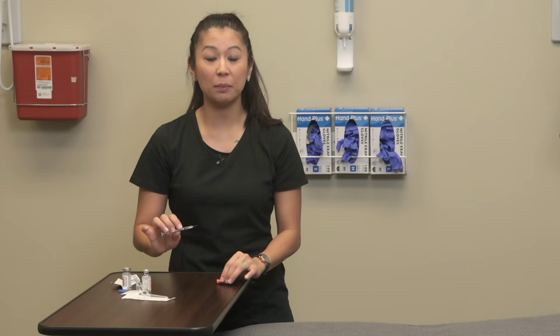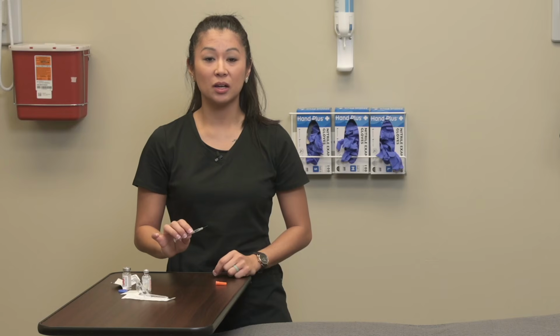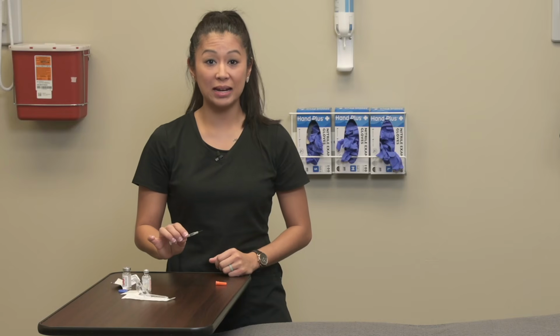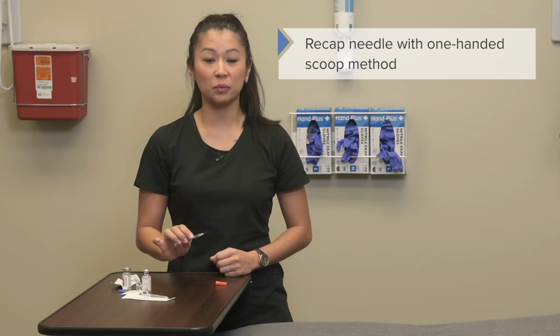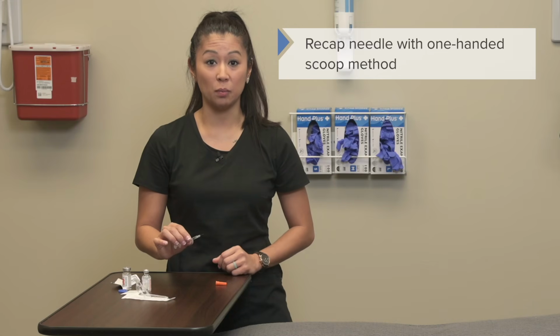This is what we absolutely do not want, and it's really prevalent that nurses get needle sticks in the hospital. So we need to be really careful about this. So the appropriate way to recap your needle, if you're in the medication administration room preparing your med, is to use the one-handed scoop method.